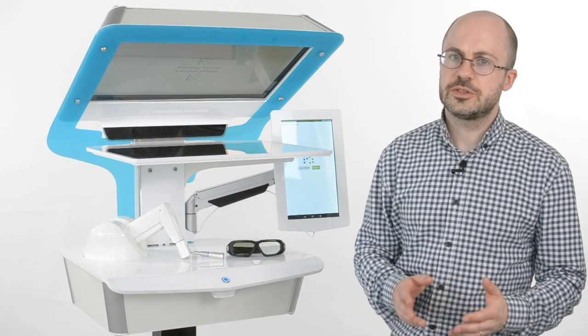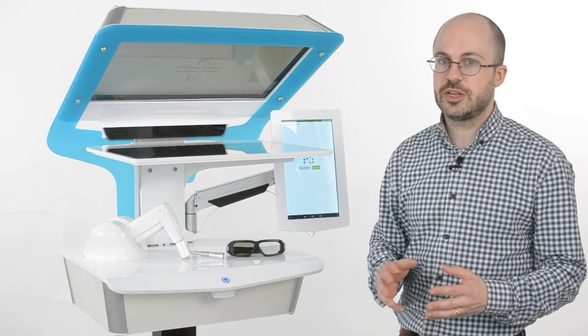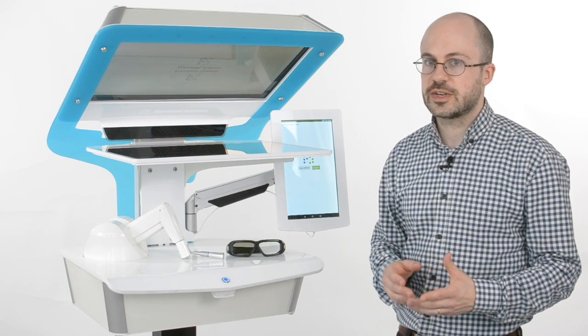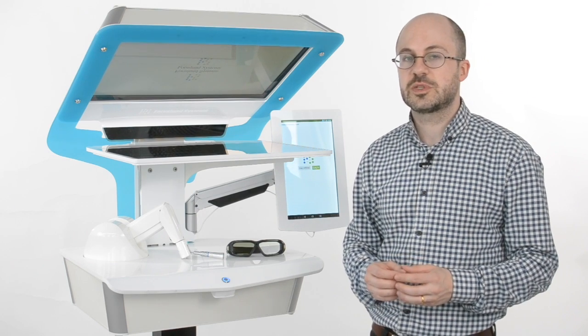The simulator comes with two 3D glasses and a large monitor so two users can view the simulation at the same time. This is very useful when a teacher instructs a student in the best way to handle the instruments and how to treat a specific patient.